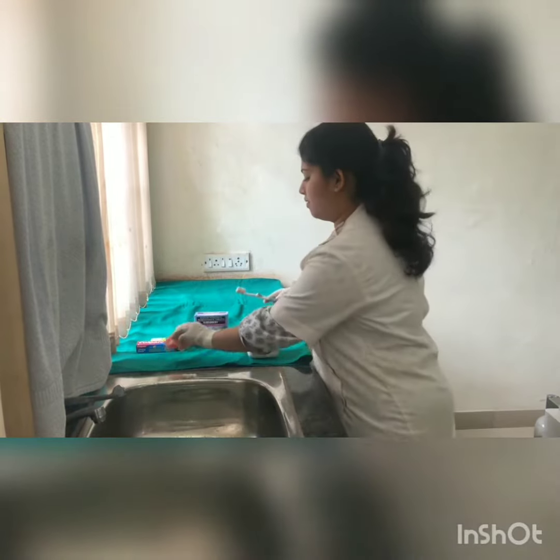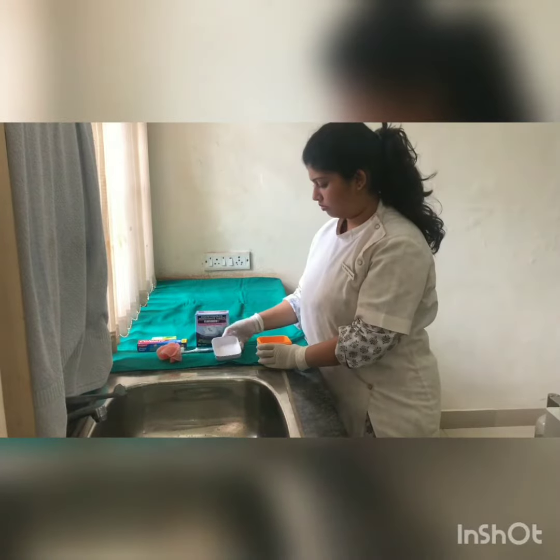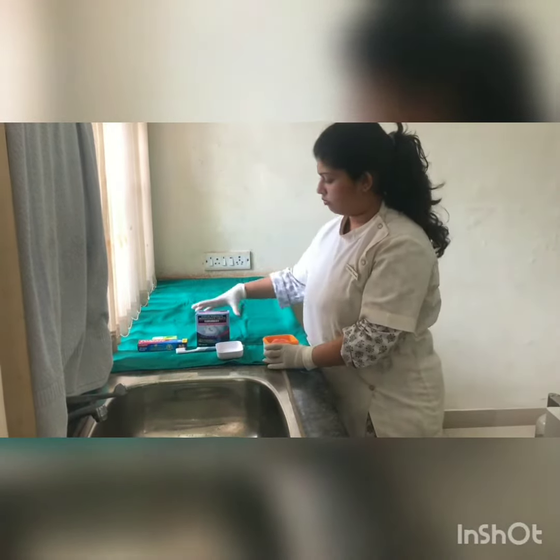Do not wear dentures at night and store them in a container in cool water. Preferably use a denture cleanser as prescribed by the dentist.